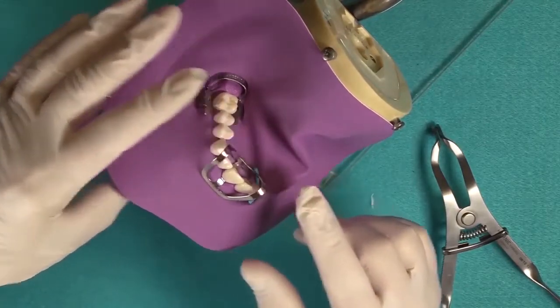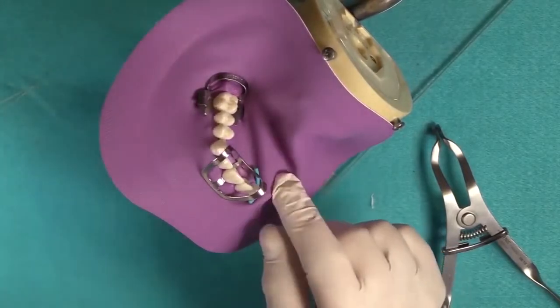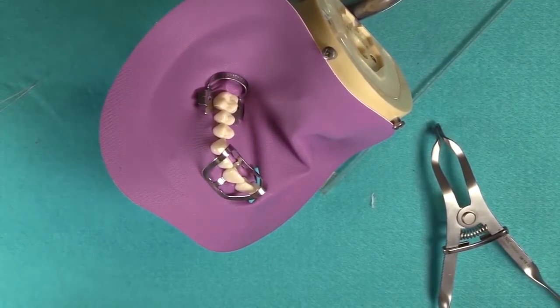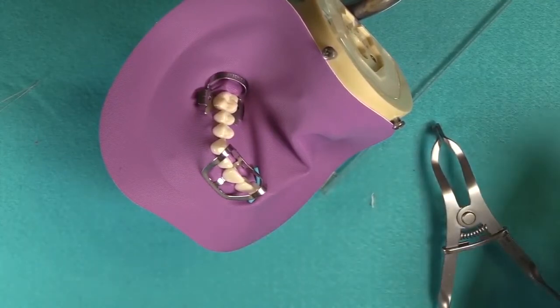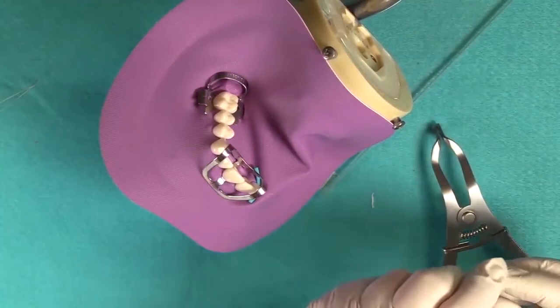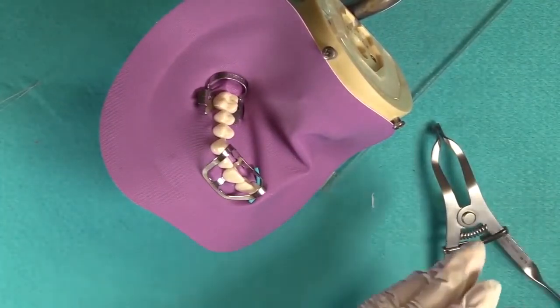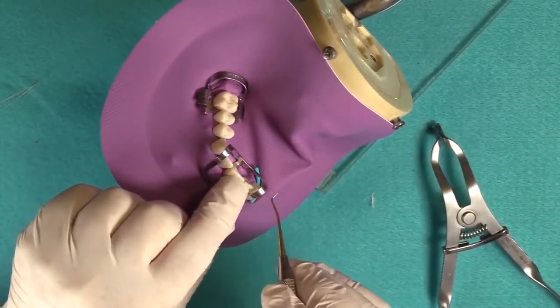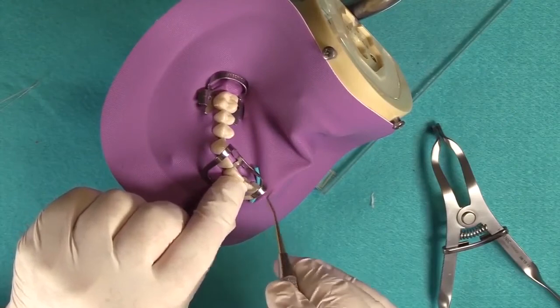And this is what I'm talking about, see? It can rock. So normally what we would do is use green stick compound. I know it's a very old product, but it's very stable when it's hard, and brittle in its natural state. When you heat it up, you heat it until it melts like taffy, and then you put it in a little warm water to temper it so it's not so terribly hot. You would have a wet gloved hand, and you could take a little piece off while it's still in the taffy state and roll it like a little cylinder, and you would lay the material over the bow so it extends over the bow and partially onto the teeth.